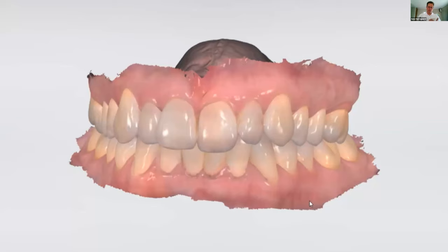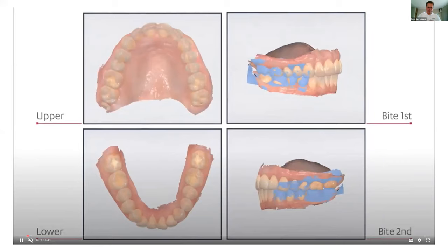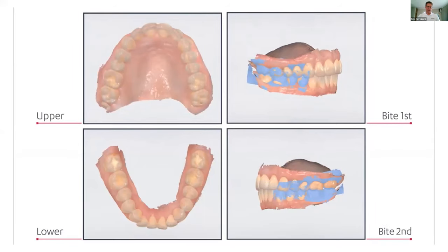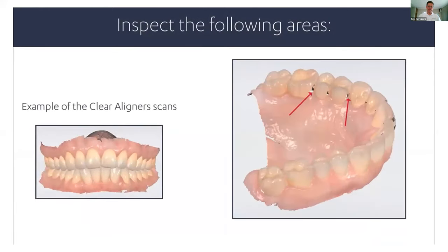So obviously we see here that we need a scan of both the upper and lower, and that's what we're going to see through this little presentation. We are scanning the upper and then the lower. And after that, we need two bite registrations, a left and a right side, in order to bring the two scans together in the patient's bite.